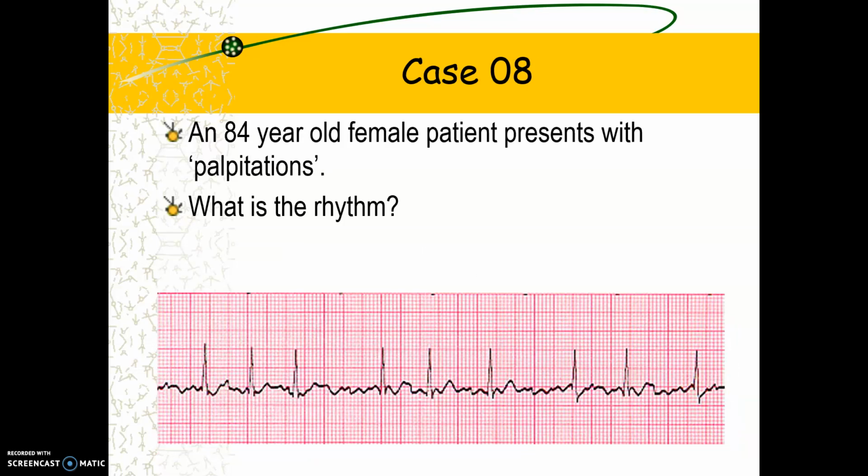So it's a bit different. This is a patient with palpitations, an elderly patient with palpitations. So what's the rate? Well, there is a variable rate. When you look at some squares, less than about 2 big squares between the QRSs, that's about 150, and then some have 4, that's 75. So it varies between 75 and 150 beats per minute. And that is because if you look at the distribution of the QRS complexes, they are irregular.